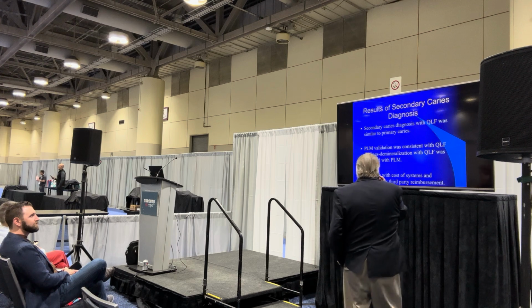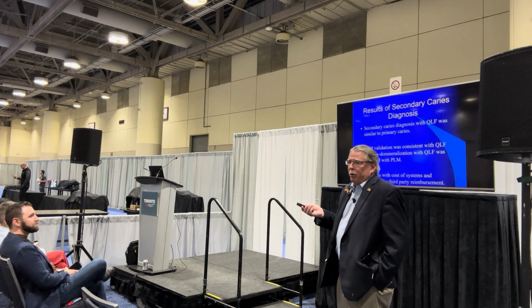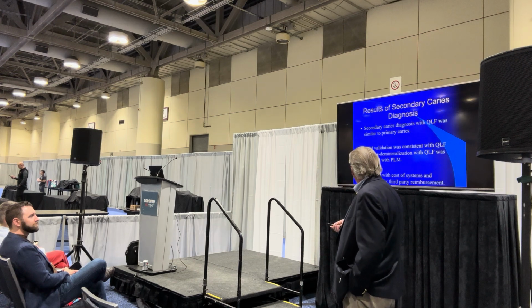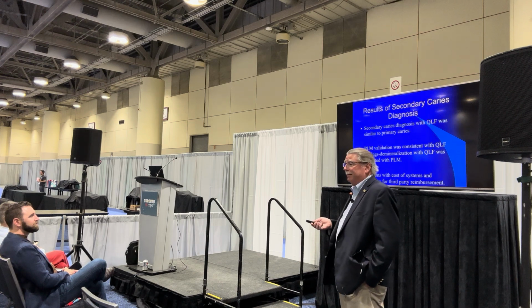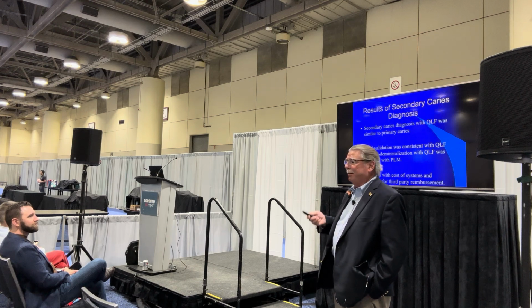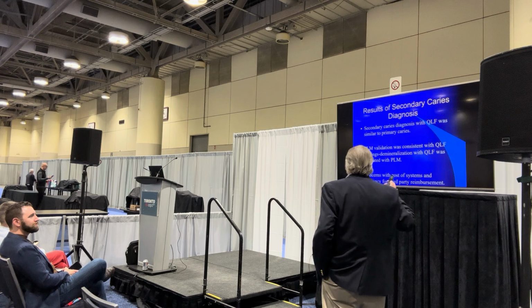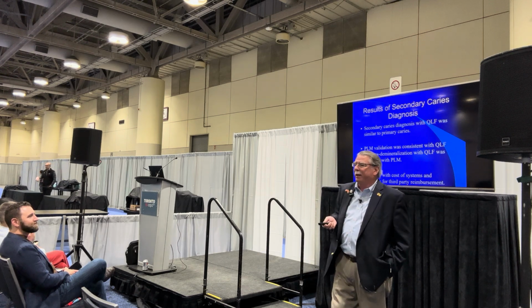But what we found with that is secondary caries were basically same diagnosis as primary caries. We could see them the same as primary caries. And we validated all those. So by this time we had a heck of a lot of happy kids that were in our studies because they're getting $25 a pop for these teeth they're sending back to us. So everybody's happy. So we finish it, and what were our big concerns?